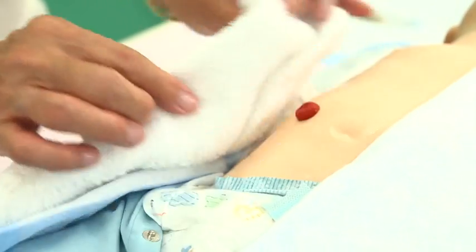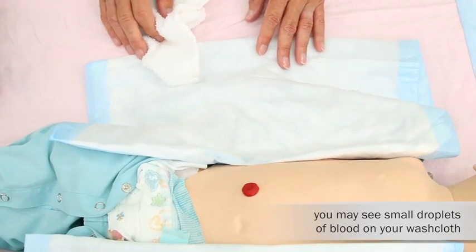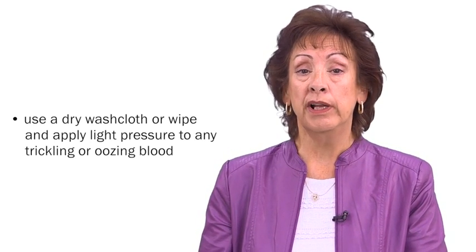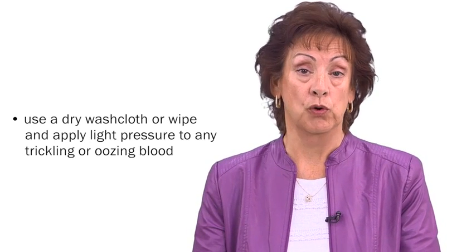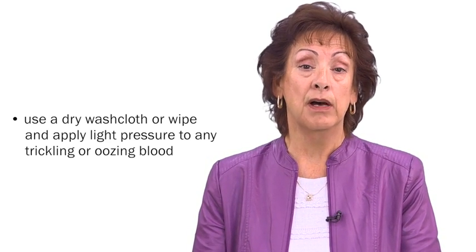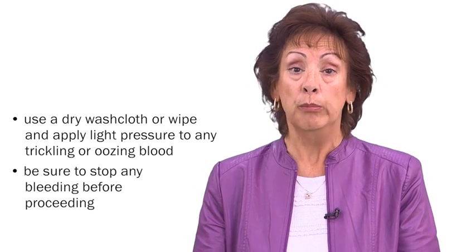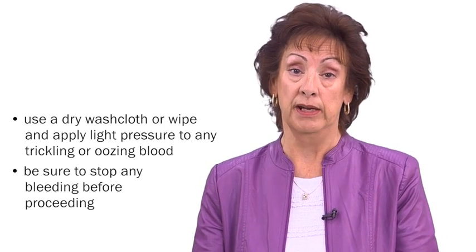You may see small droplets of blood on your washcloth or towel when you wipe the patient's stoma. This is normal. If there is a trickling of blood oozing from the stoma, then take anything clean and dry and apply light pressure. Be sure to stop all bleeding before proceeding.